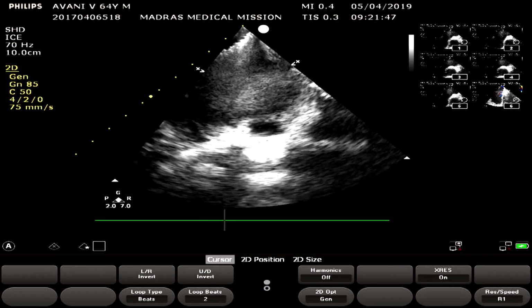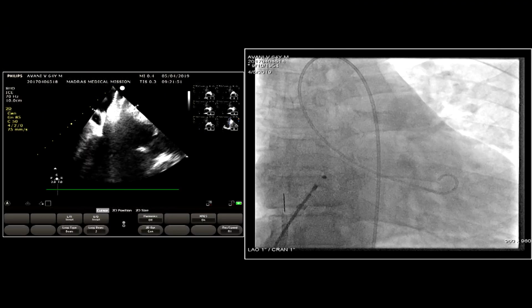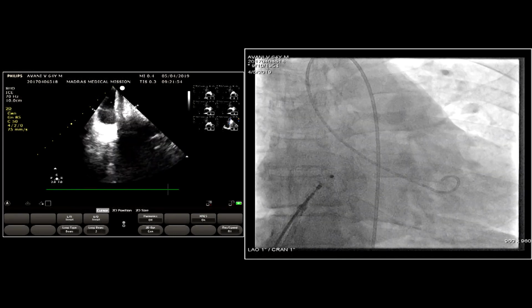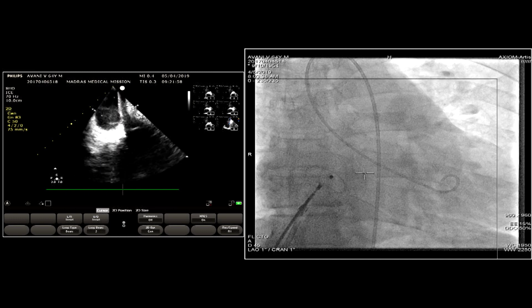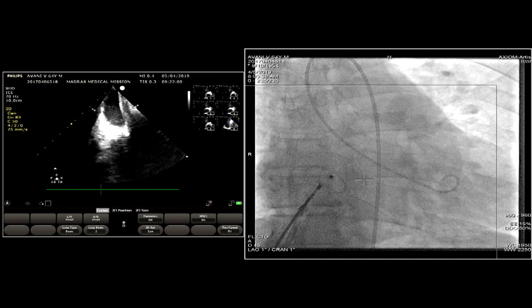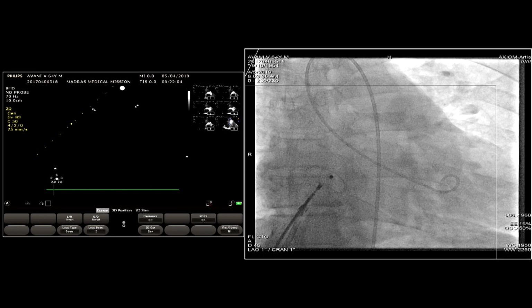Claire, would you have chosen a larger device? Srija, we can swap over to the thoracic and show us. I'm finding it a little bit hard. I was just saying I haven't done a lot by ICE. I did one on a guy who was really high anesthetic risk, but I find it a little bit harder to judge on the images we've seen so far. But I'm sure they've got someone there who's had a good look. But yeah, it does seem to be moving a little bit.